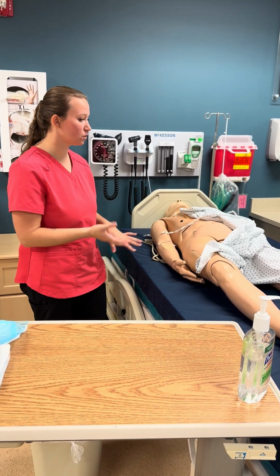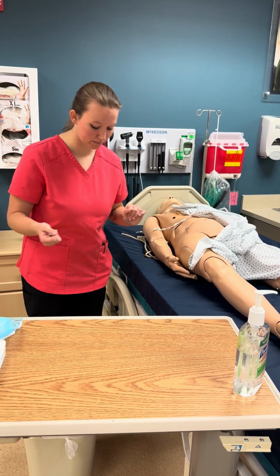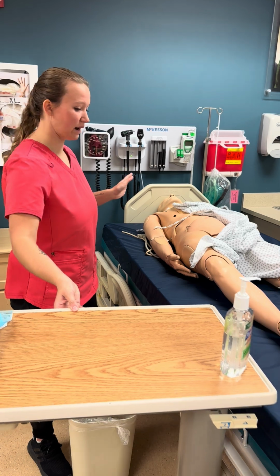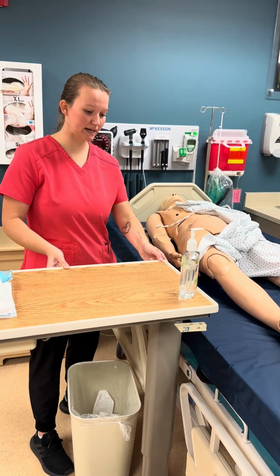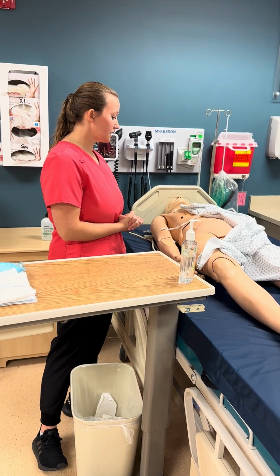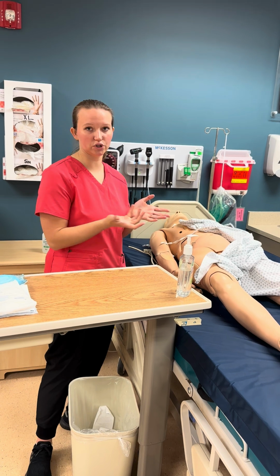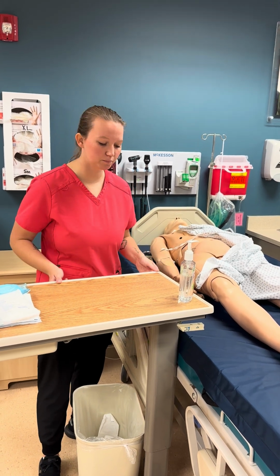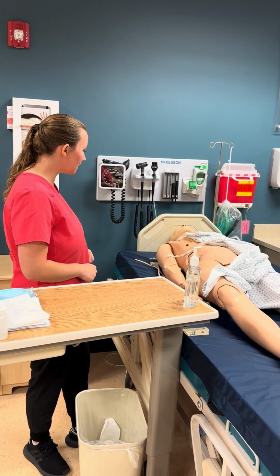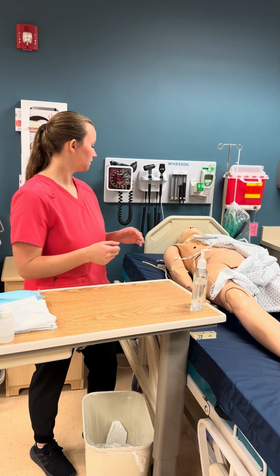While assessing the wound, I'm also going to note if there is any sort of infection. I would look for whether Joe has a fever, if the site is red or warm around the area, any change of consciousness, so redness, warmth, swelling, and purulent drainage would be present. All right, Joe, since I've got you exposed and your dressing is off, I'm going to go ahead and set up my sterile field, okay? Okay.